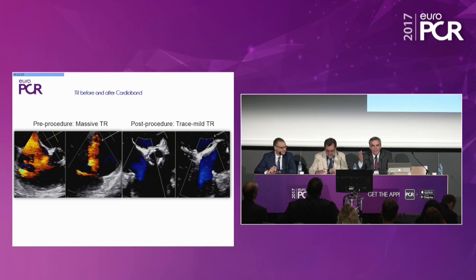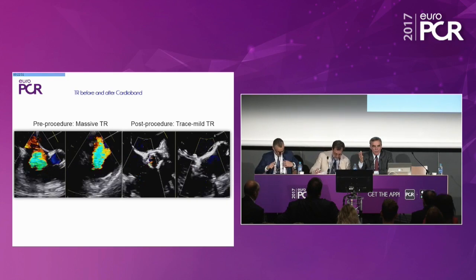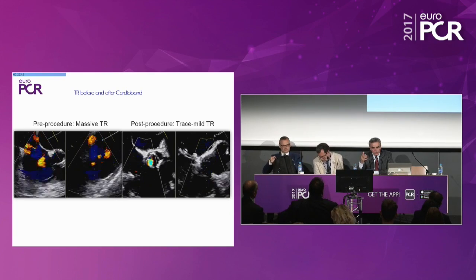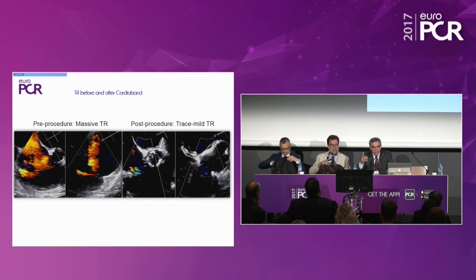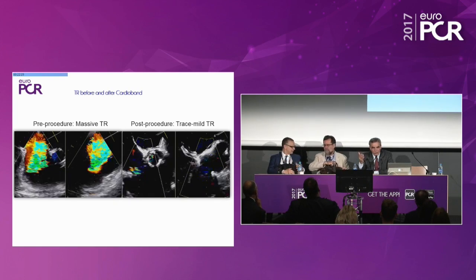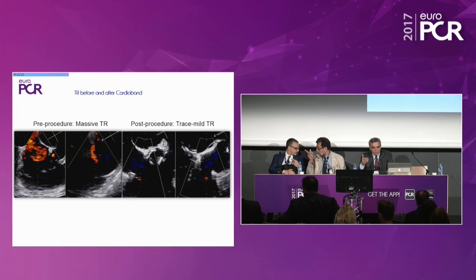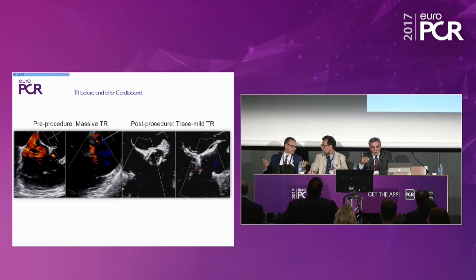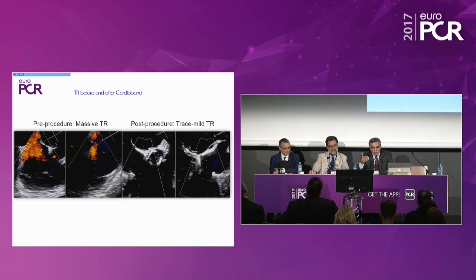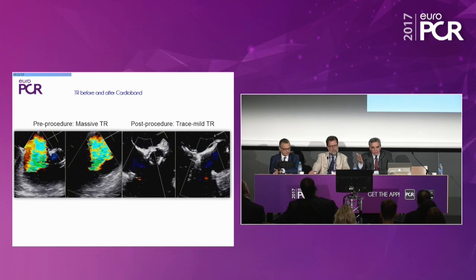So, ladies and gentlemen, is there any burning question from the audience that we need to discuss that we didn't cover? If this is not the case, I would really like to make a very short summary. I think the session has shown that the Cardioband is a very important addendum to intervention technologies for both the mitral and the tricuspid valve. The mitral is at a very advanced stage of experience with proof of concept to show that it can safely be done, that it leads to reproducible reduction of annular diameters and thereby significantly affects mitral regurgitation. And we are just in the process of copying these results for the tricuspid side, which I believe is even more important, because doing a clip procedure on the right side is much more challenging since the device has not been built for the right side, unlike the Cardioband, which actually is a copy of the left-sided procedure.